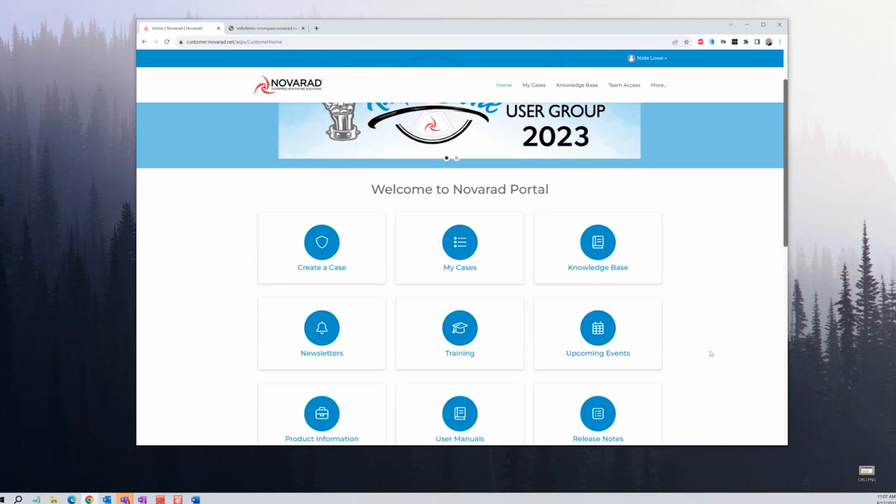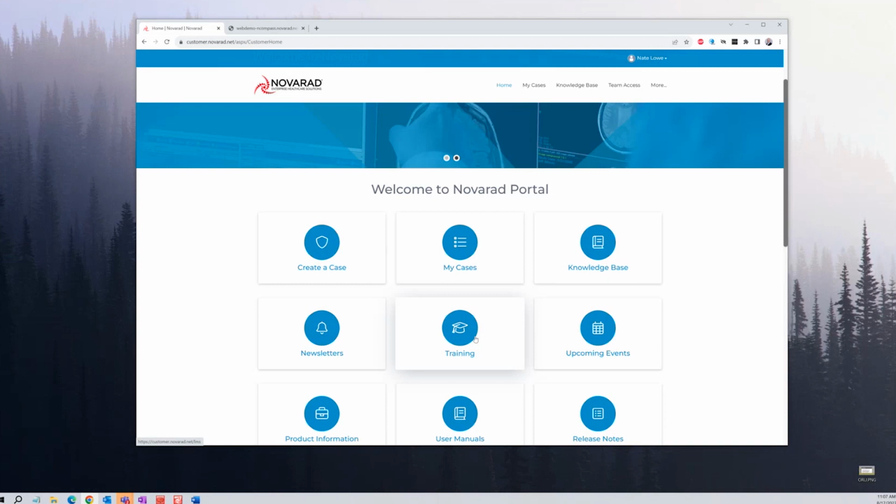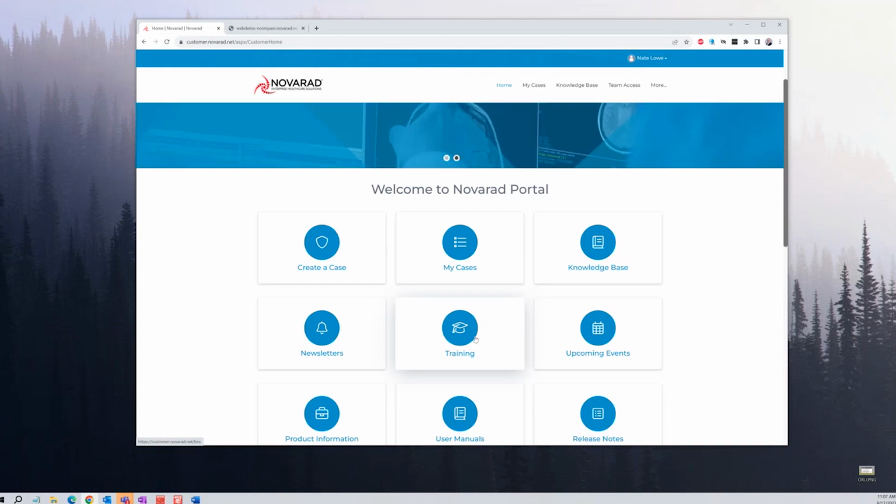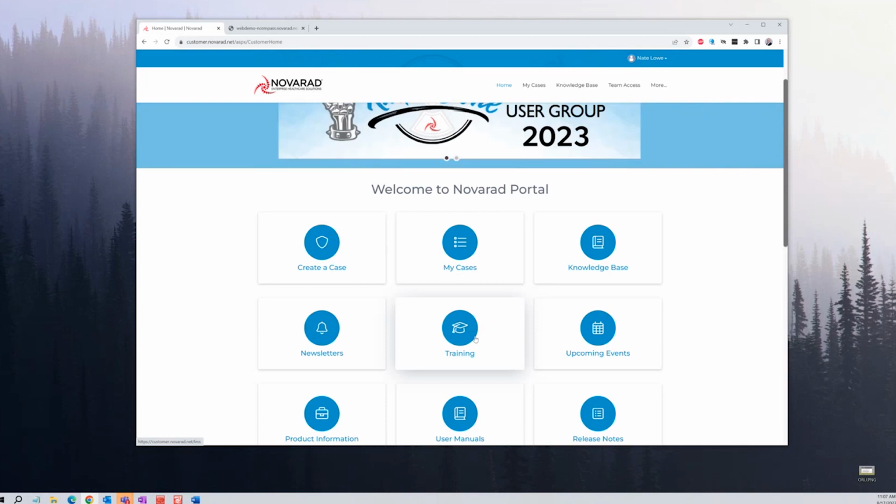All right, moving on. Training. We don't have anything in training right now, but we do have big plans for this section. We are working with ASRT and ARRT to get free credits, CE credits, just like you're going to get for attending this class. We're going to have online training associated with those credits. So you can see, you'll be able to look forward to that coming up in the future.